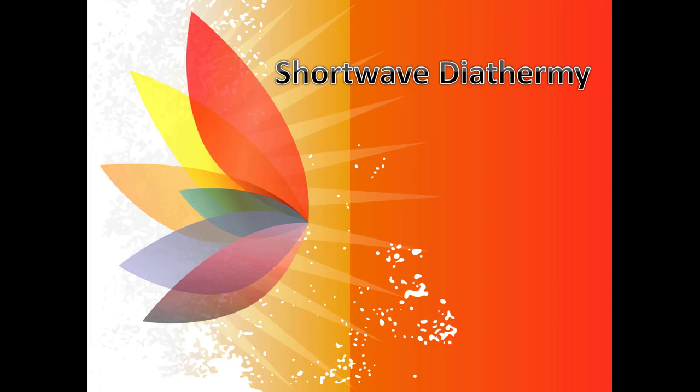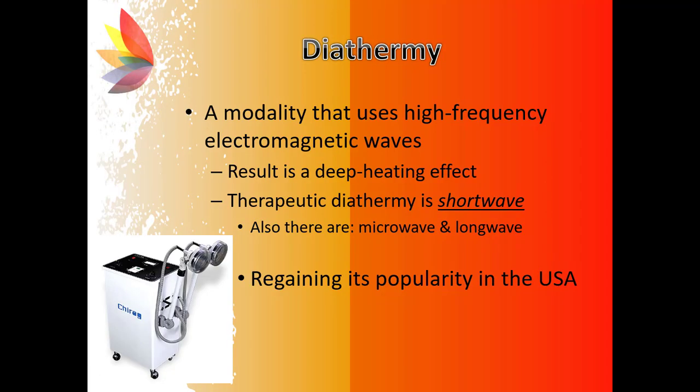Shortwave diathermy. Shortwave diathermy uses oscillating high-frequency, non-ionizing electromagnetic energy to produce deep heat within the tissues. The energy created by a diathermy unit is similar to broadcast radio waves. Diathermy does not affect motor or sensory nerves, as the electromagnetic energy that is produced does not have the wavelength or duration to activate these structures.